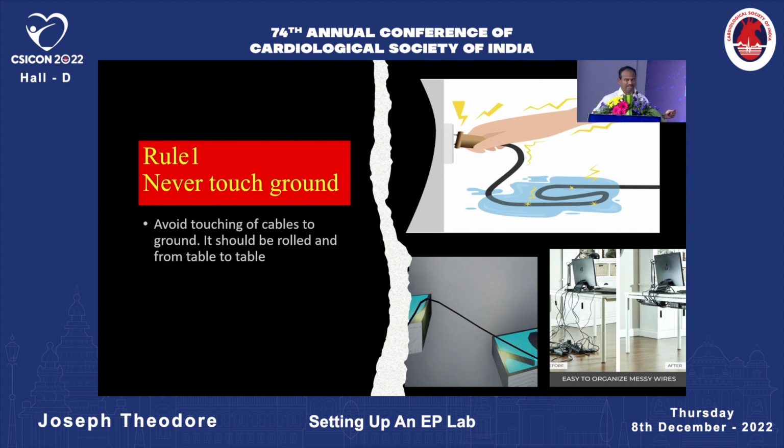And one more important thing is, when you're using a 3D system, your optical fiber cable should be insulated and should be going across to the 3D machine.